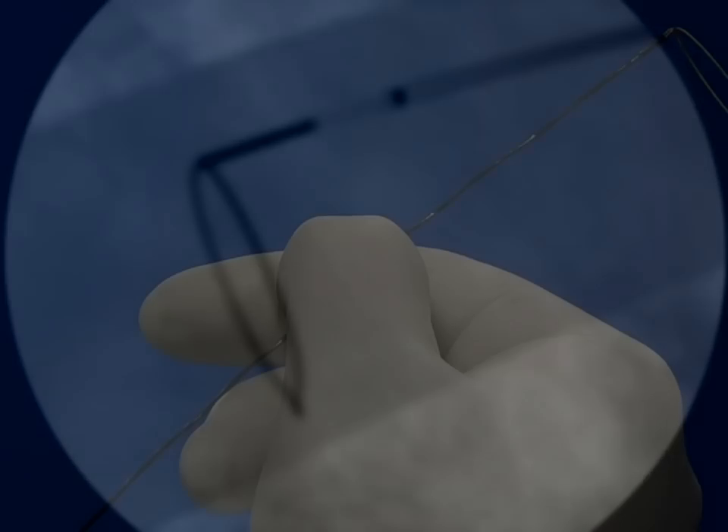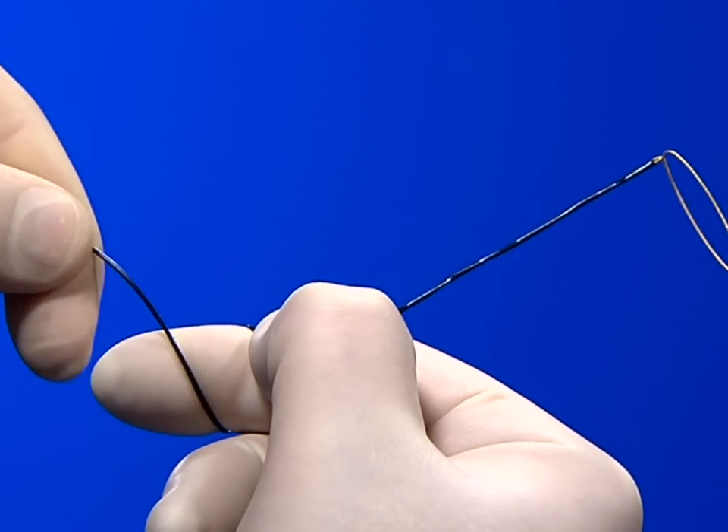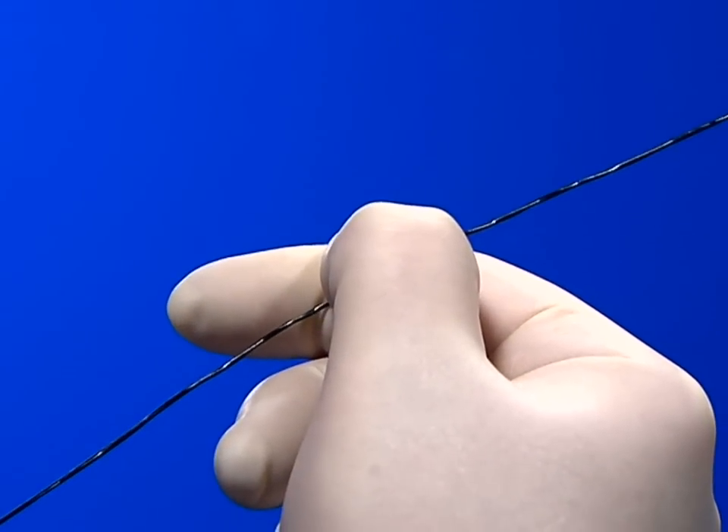For structural integrity, the nitinol core wire provides kink resistance and durability as well as flexibility for necessary torque and vessel navigation.